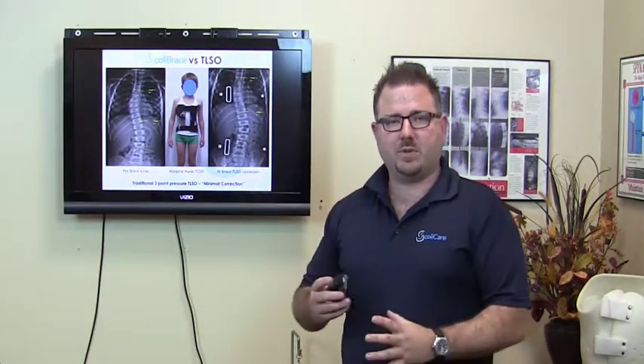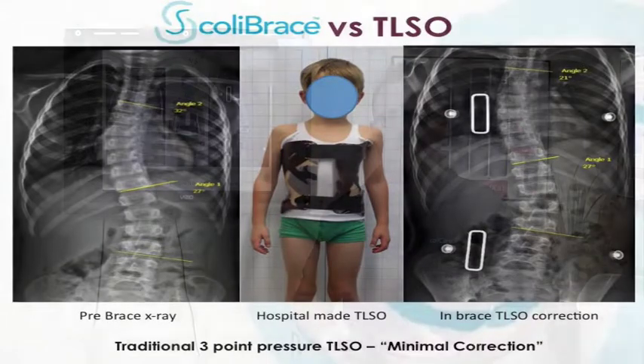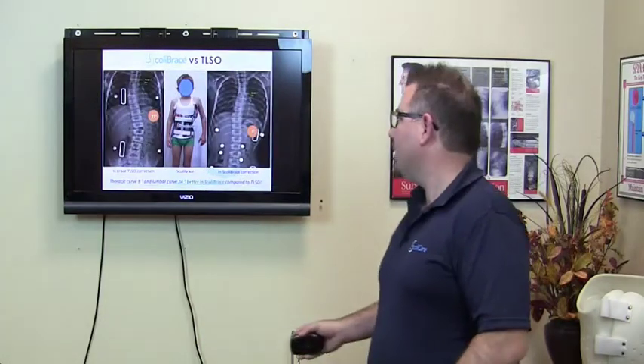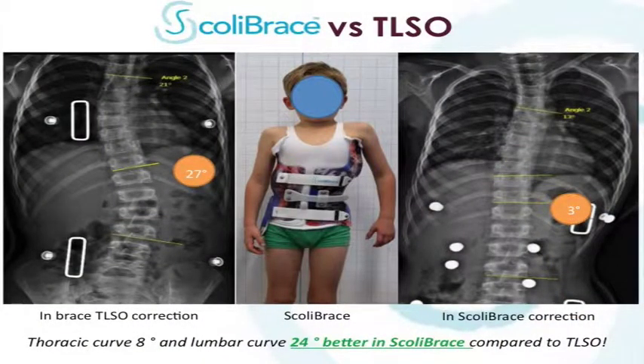Here's another example of the difference between our three-dimensional overcorrective Scolibrace and the traditional hospital-made TLSO or Boston brace. This is a slightly different version of a hospital brace, open at the front, but the corrective principles are the same using three-point pressure. You can see that the top curve has reduced a little bit from 32 down to 21 degrees, but the bottom curve has remained the same. These x-rays were taken on the same day — the x-ray on the left shows the correction in the hospital brace, and the x-ray on the right shows the correction in the three-dimensional Scolibrace.